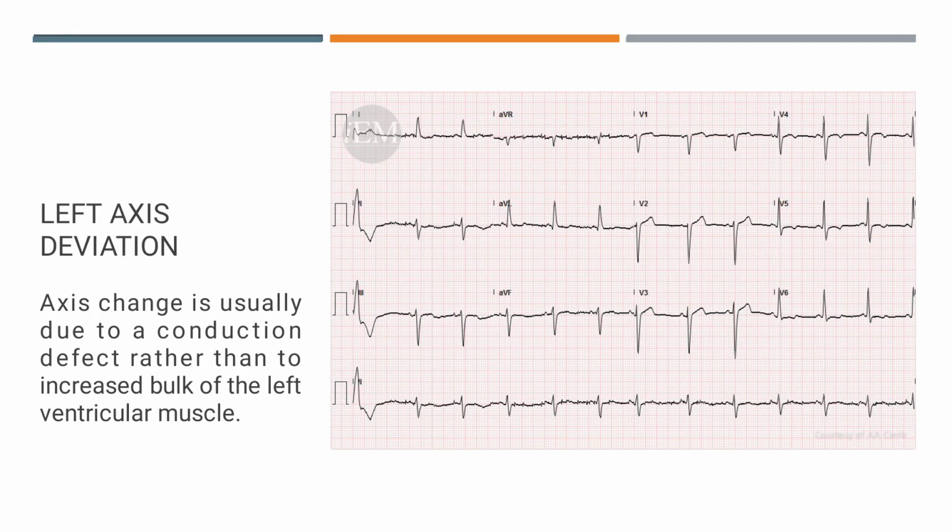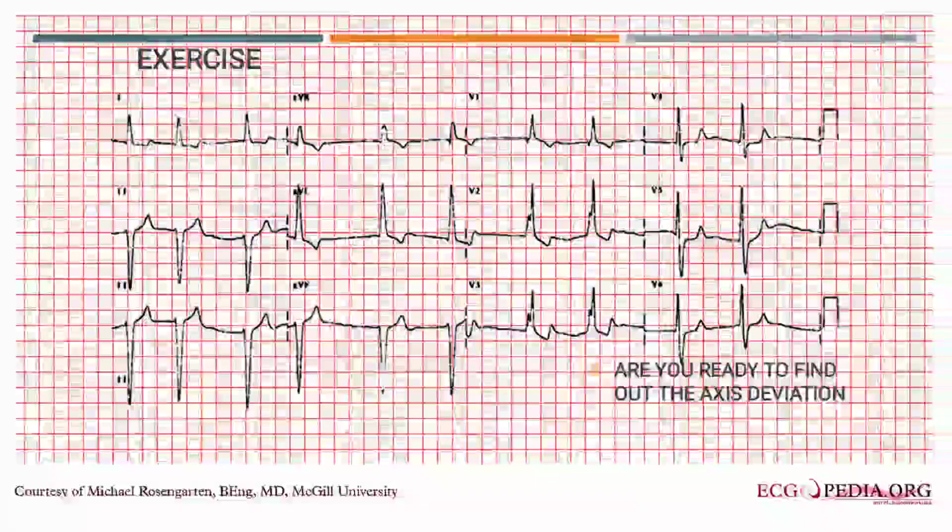And why is it happening? It is due to a conduction defect rather than increased bulk of left ventricular muscle. So this is all about axis deviation.